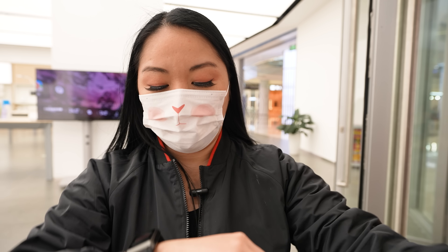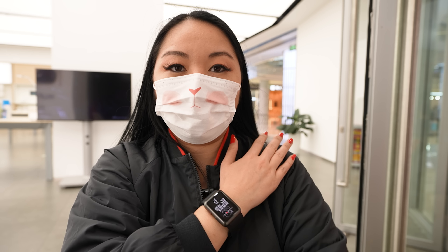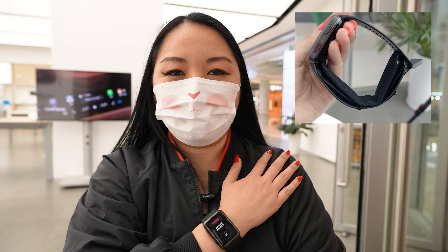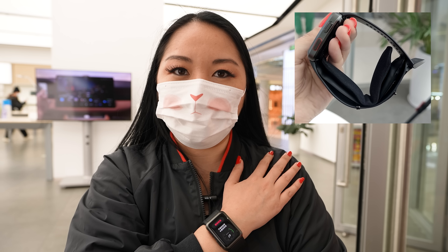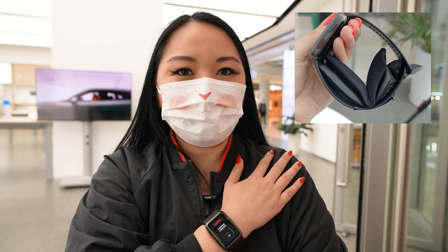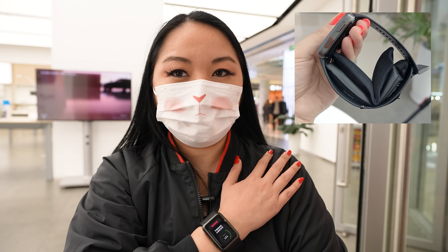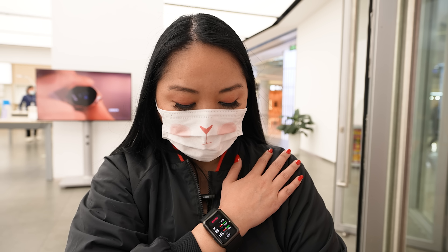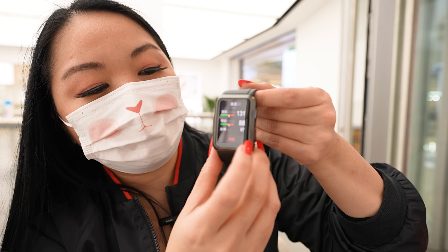I thought it would work together with the other device but it doesn't, as it needs a specific position. So let's measure again: you come here, choose the function, and you have to put the arm at shoulder height. It started! It's very interesting because I started to test it and I didn't think it would inflate with air, but it does — it taps just like a traditional medical blood pressure device. I didn't think it would press so firmly, but it had a certain force, yes. And you can see a result on screen.